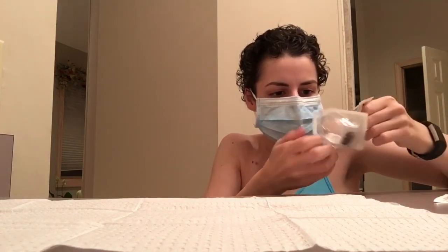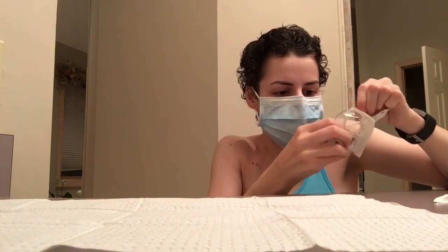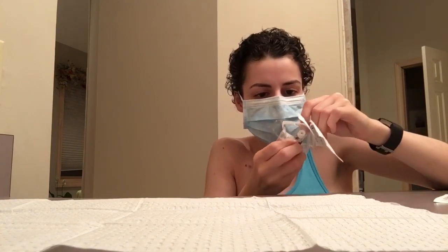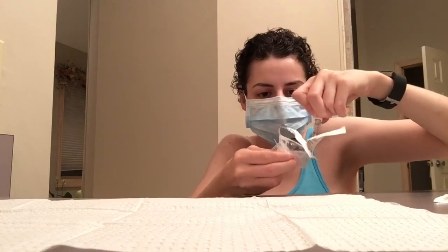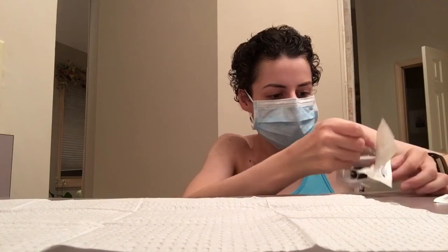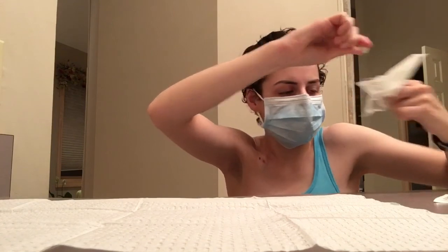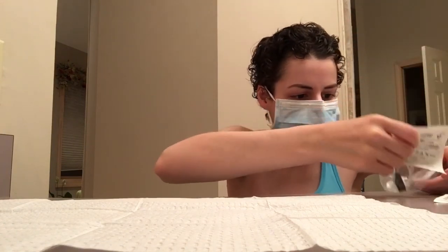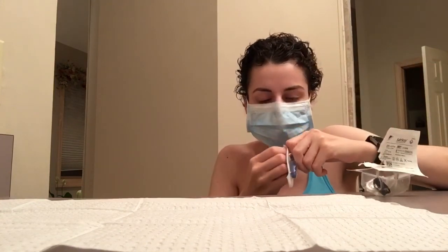So what I'm gonna do is open this, and I'm just gonna hold the plastic part so I'm not touching anything of what's actually inside because that's sterile. And I'm just gonna grab this white cap because that's what I'm taking off, but I can't touch anything else. So I hold the plastic and unscrew the white cap, and I sit it right here because I can't put it on the sterile field yet. That attaches to the blue cap, so I take the blue cap off and then put them together.